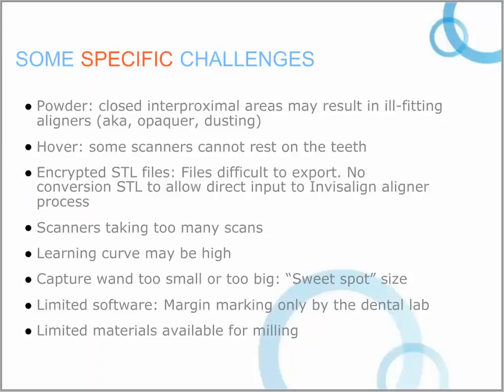By the way, STL, for those folks that don't know, is standard tessellation language and is the file type that we use to describe the iTero file, the digital scan. It is the common file system used for digital scanning. Often, some of the scanners that we've seen in the past simply take too many scans and therefore make it cumbersome to use, and again, make it difficult to train new operators. The learning curve may be high, and if that is the case, that's a challenge in your office.